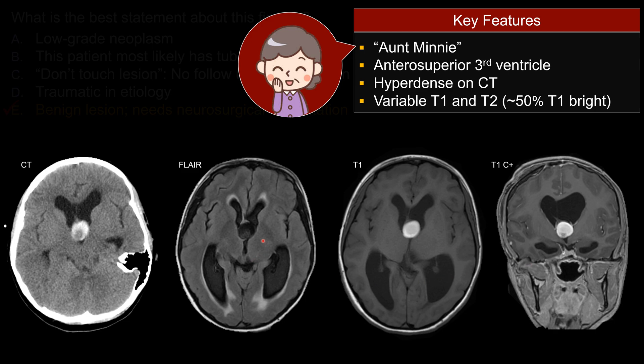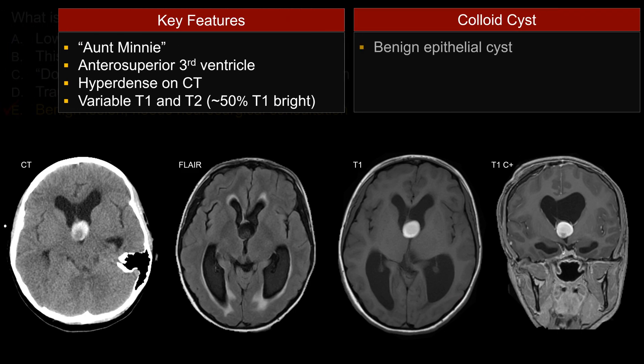On T2-weighted sequences, which I don't have the image here to show you, the signal could be variable — it could be bright on T2, isointense on T2, or sometimes hypointense on T2. So this is a classic example of a colloid cyst — again, an Aunt Minnie.